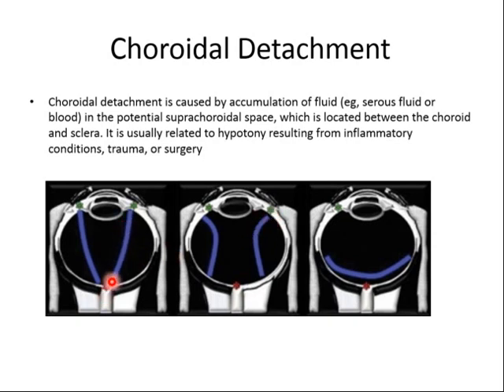But here this funnel-shaped one is retinal detachment, attached to the optic disc posteriorly. And this one is a vitreous detachment, a membrane in front of the optic disc, and it is highly mobile.